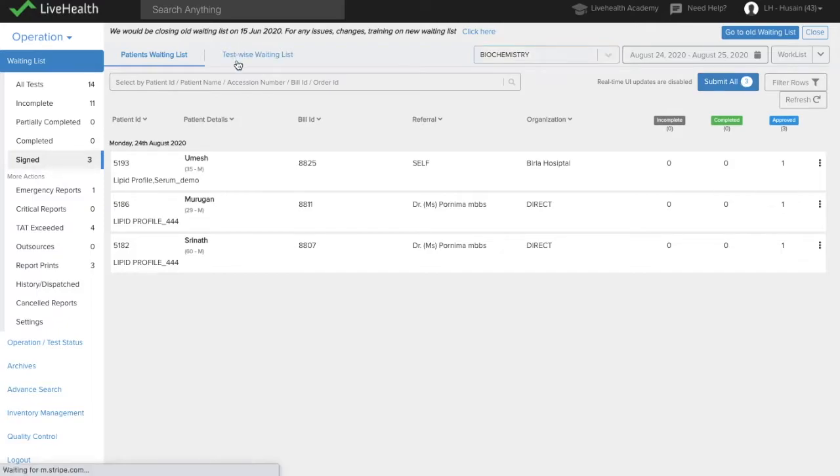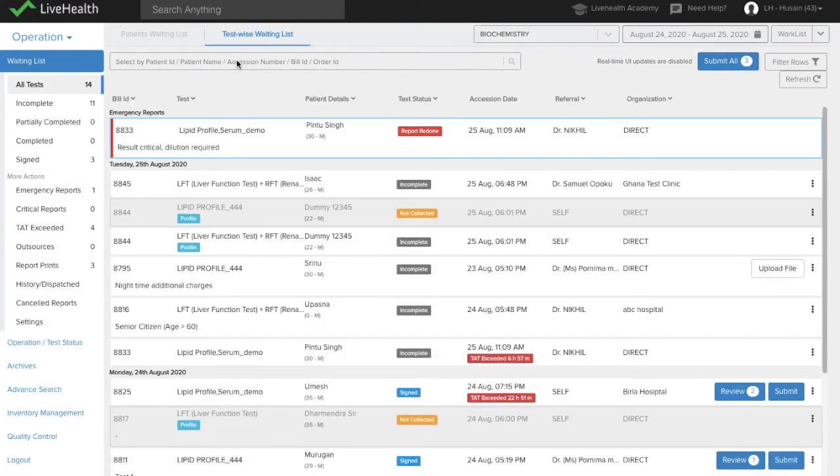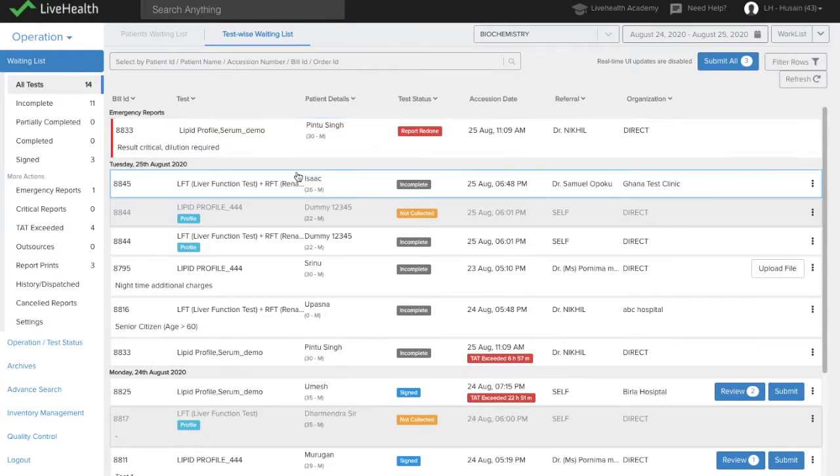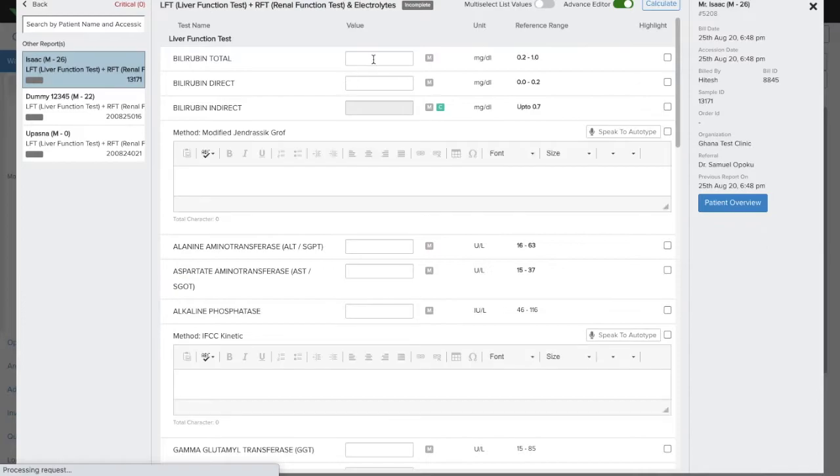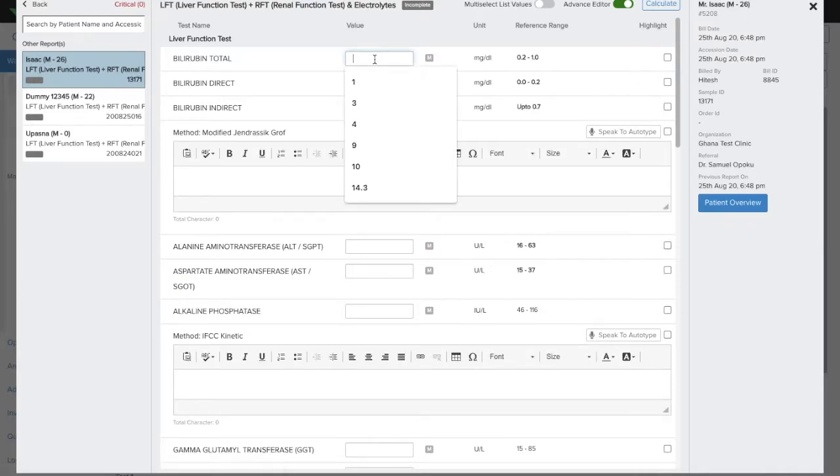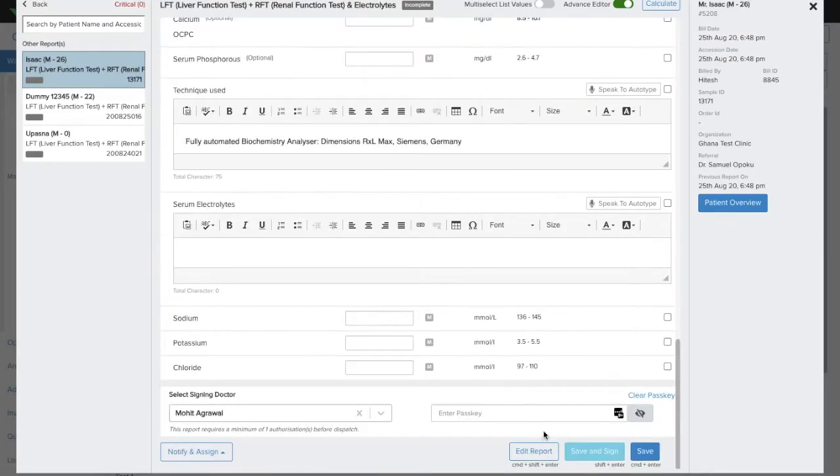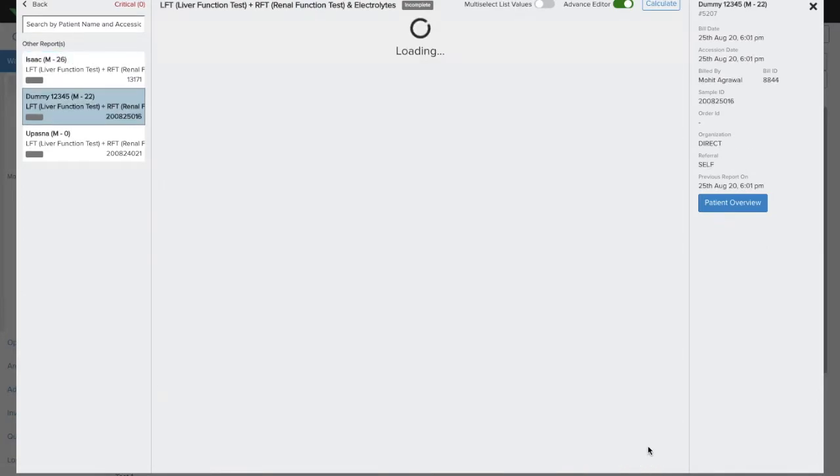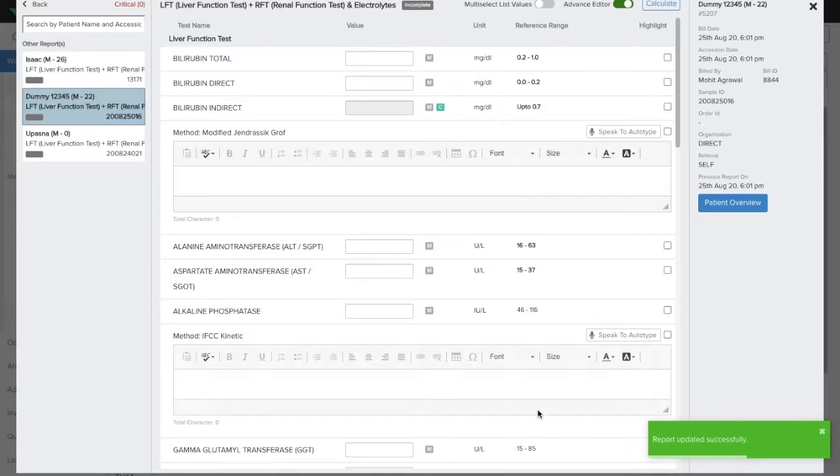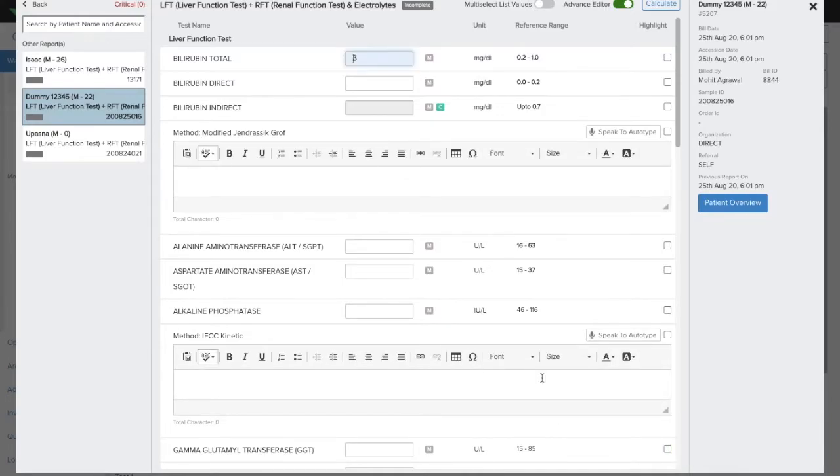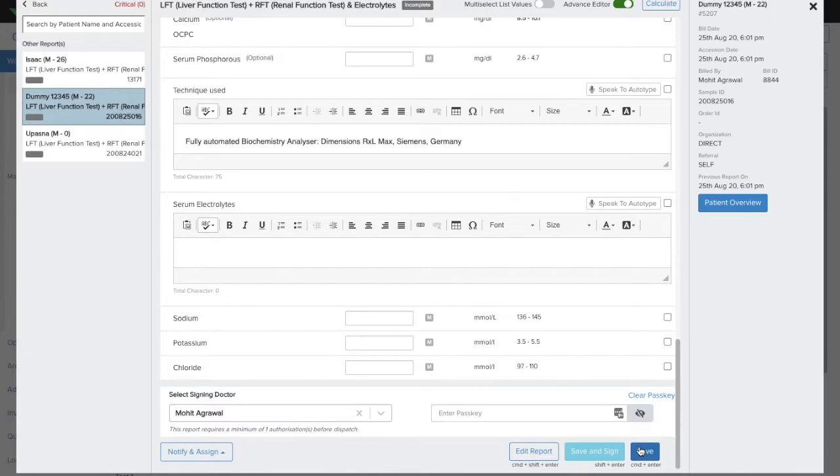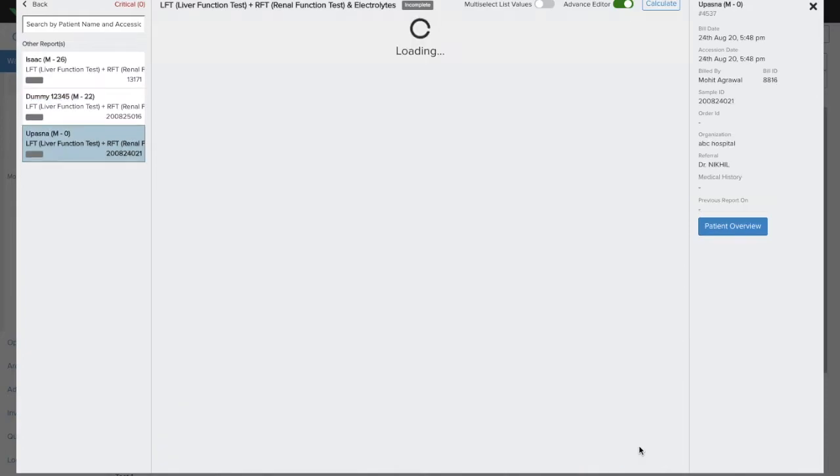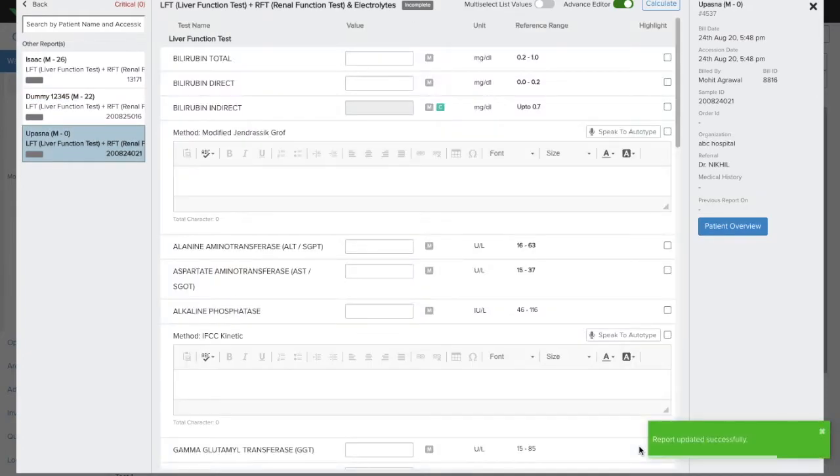The new waiting list also allows you to fill reports one after the other. So suppose if I select one test LFT and I fill this report, save the result. It automatically goes to the next report where I can fill the result and save the result and so on.